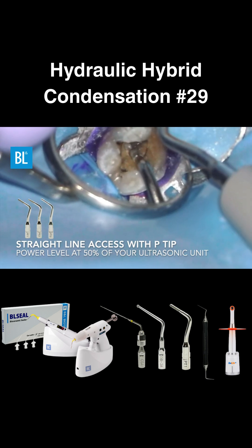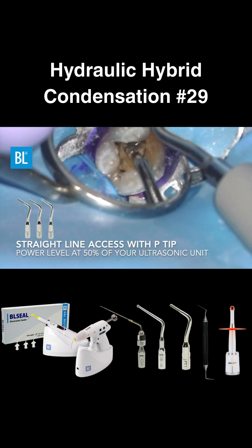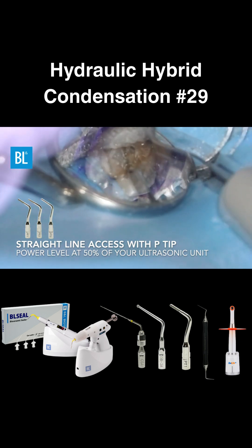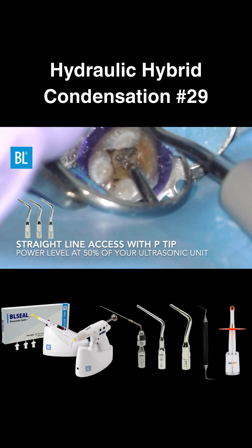Use the ultrasonic P-tip to not only see where you're drilling, but also create a straight-line access. The recommended power setting is 50% of your ultrasonic unit.